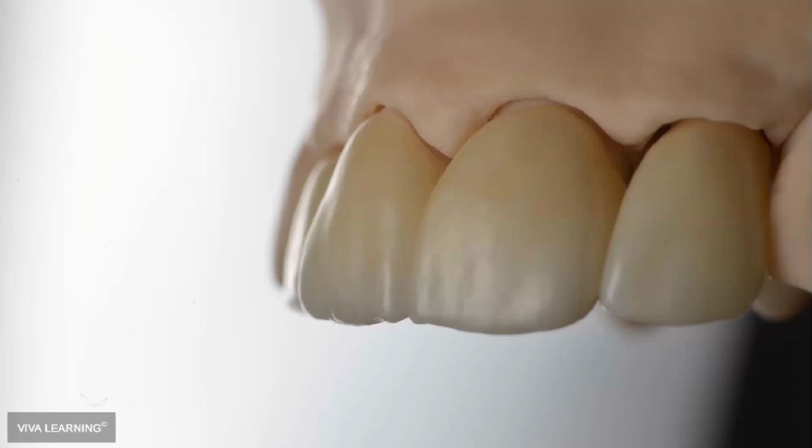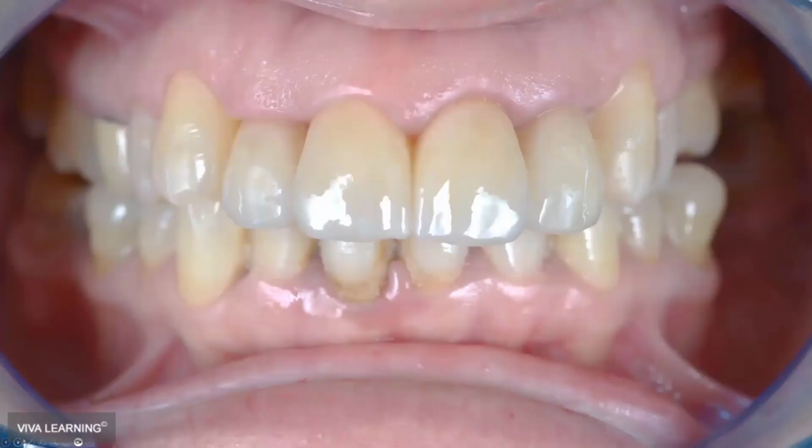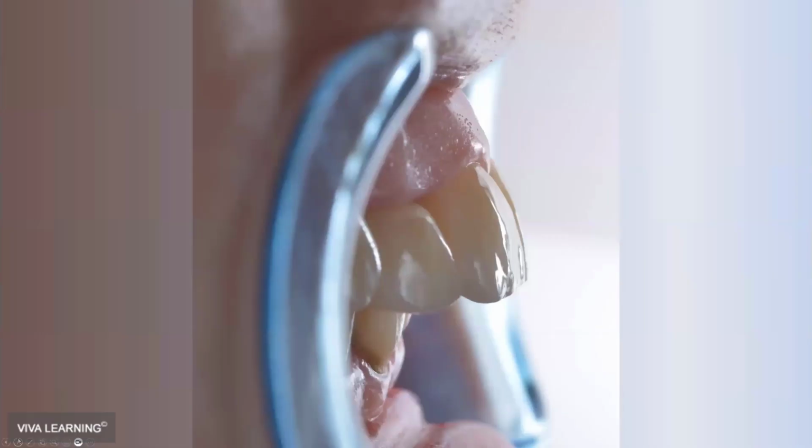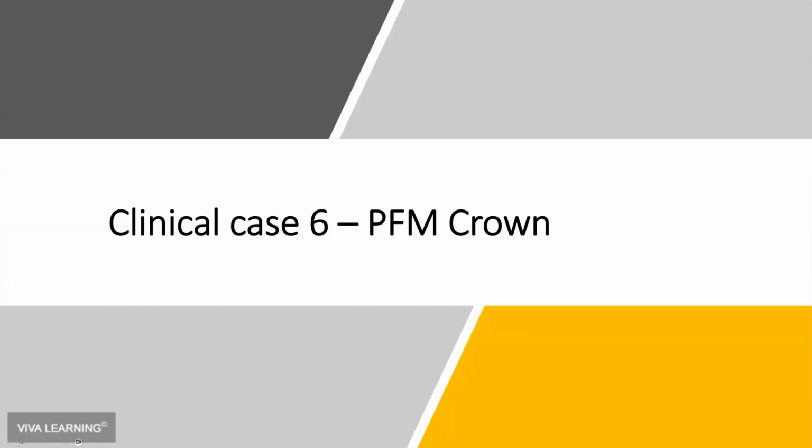Those are the crowns and veneers on the printed model. At the cementation appointment, I decided to isolate everything with dental dam, and this is the tissue health after the cementation. And you can see that all the margins are at or below the level of the tissue of the gingiva. And this is the final image.